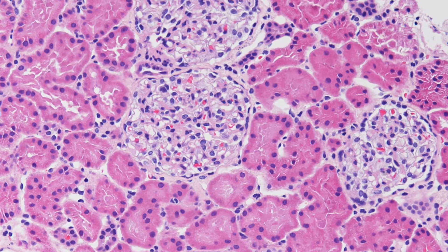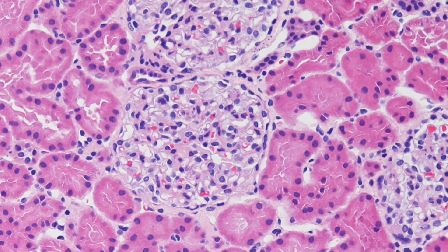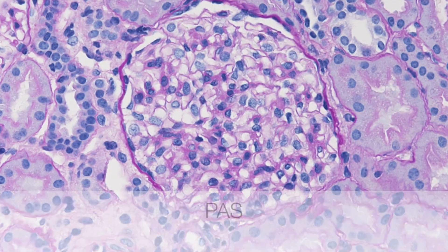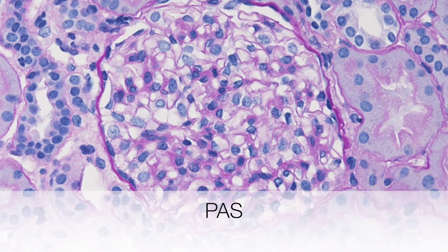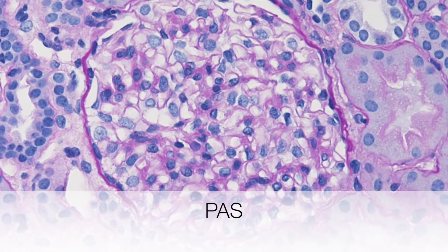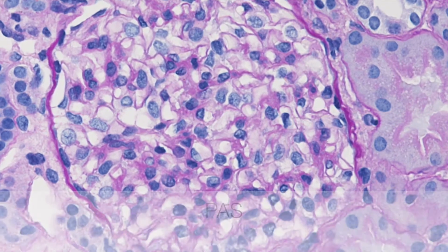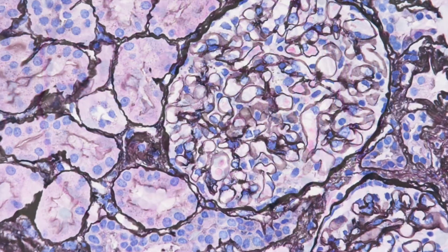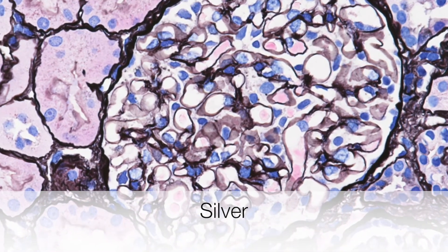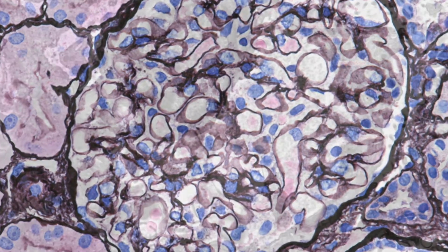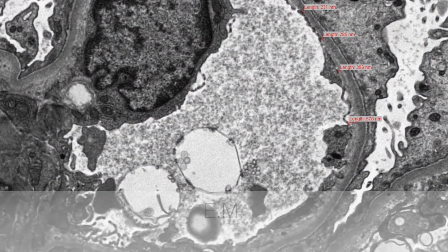This is the H&E stain. This is the PAS. This is the silver stain. And this is the electron microscopy.